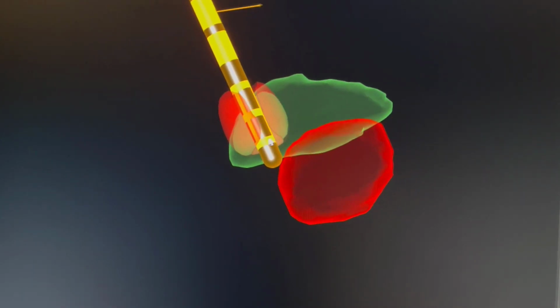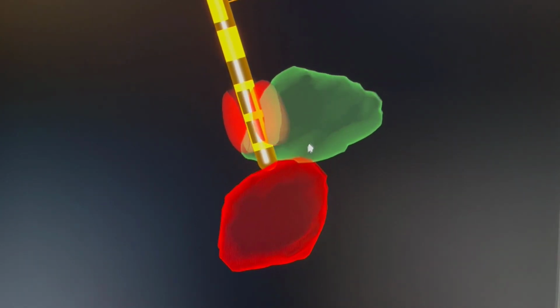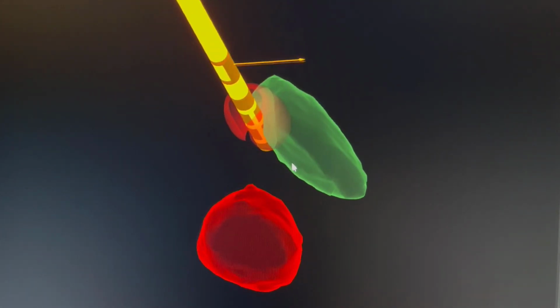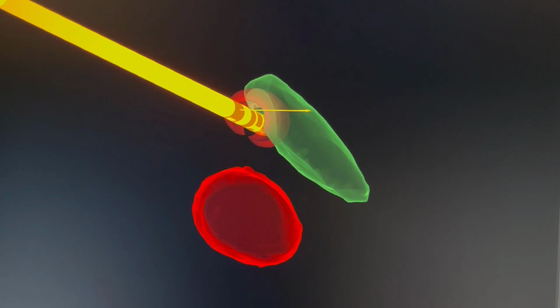And as you can see, it is necessary to look at the field of stimulation from different angles to get a good understanding of its location and how it is related to the surrounding structures.